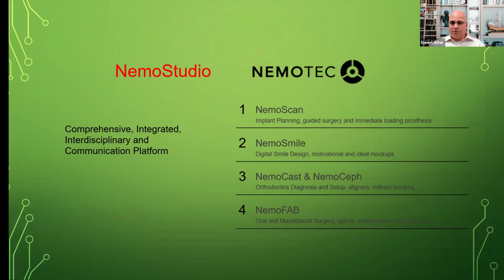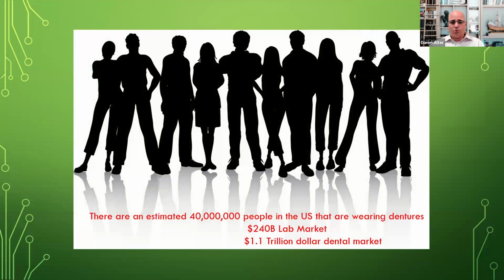When I say robust, it means that we have a larger assortment of tools within our toolbox. We may or may not need everything, but I'm always of the mind, whether it's with software or any kind of solution, that I'd rather have and not need than need and not have. That's where the robustness of this software is really impressive, because it truly has everything you could possibly need to prepare or fabricate a surgical guide, a smile design, orthodontics, or even maxillofacial surgery.